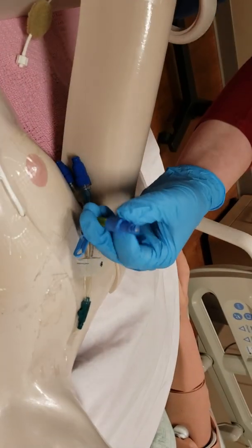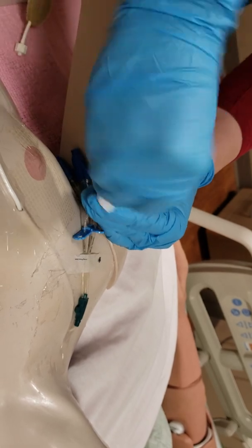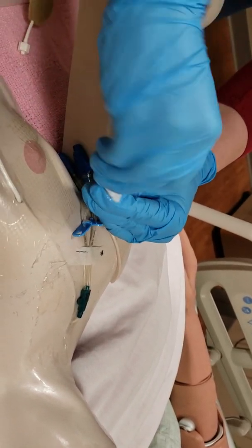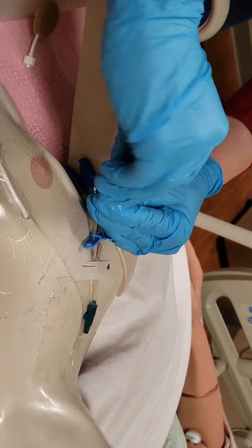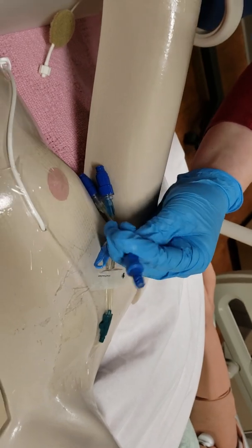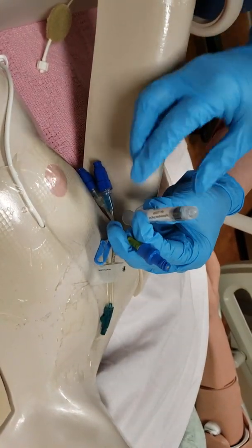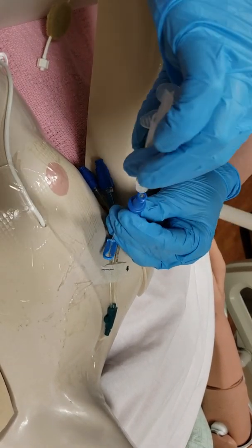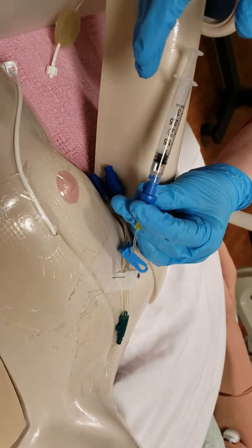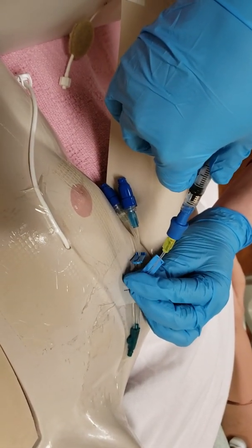Okay. I am going to swab again in between for 30 seconds. Okay. After 30 seconds, again, I am going to hold this. Going to connect, and now I'm going to unclamp, and I'm going to give this drug over 2 minutes.